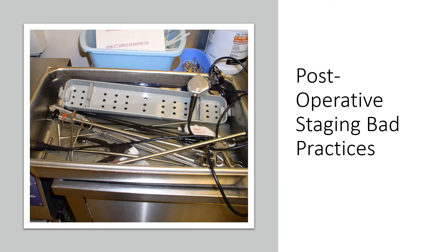Let's talk about post-operative staging bad practices. This is when the OR may be in a hurry or there hasn't been adequate education on how to properly separate and pretreat instrumentation. In this picture, there's a lot going on — the camera, lenses, rigid endoscopes — but the focus is about the insulated items at the very bottom and making sure we're separating those from anything that's metal.